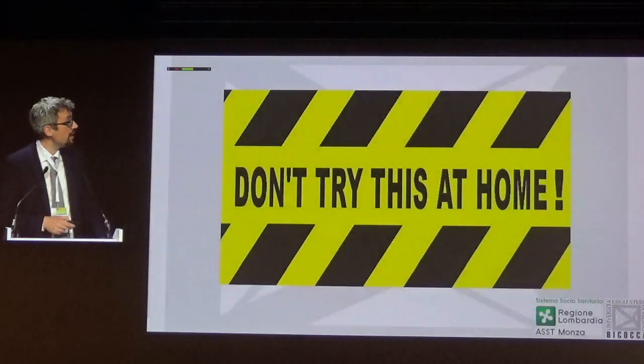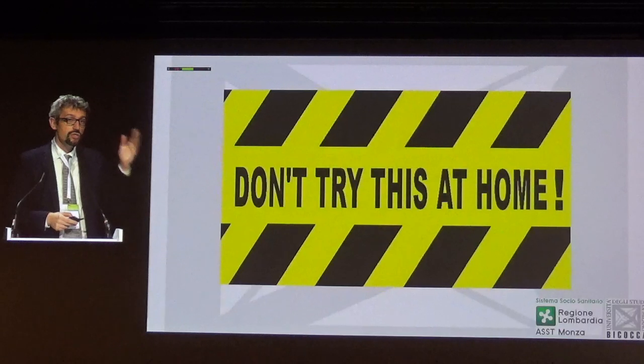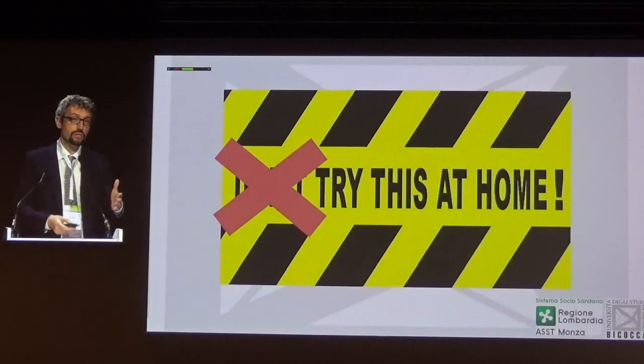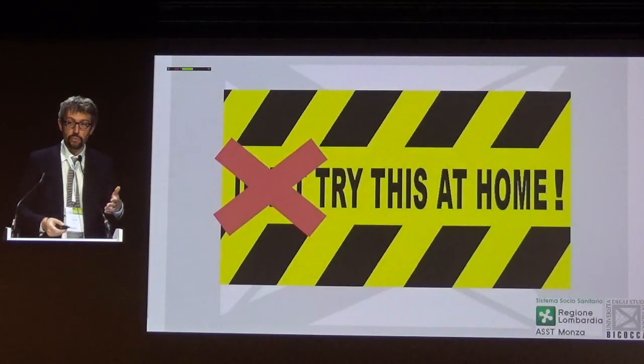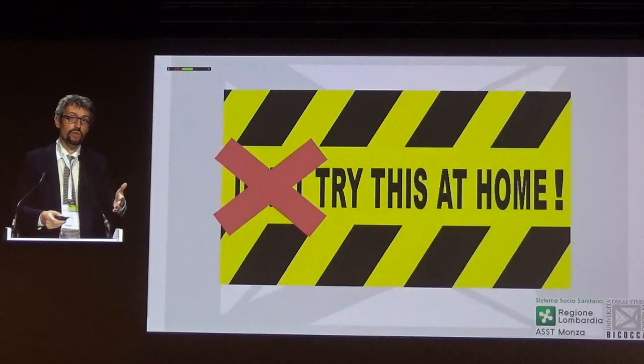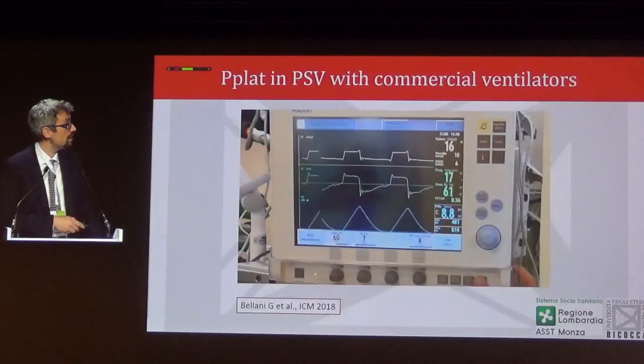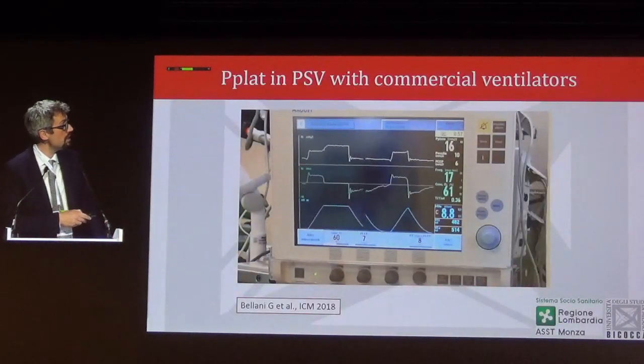The nice thing about this is that I would strongly recommend you to go home Monday morning and do this. You do not need any additional equipment, you just need a ventilator which allows to do an inspiratory hold during pressure support ventilation, which unfortunately not all the ventilators do. And we published this short movie on ICM to see how this works.